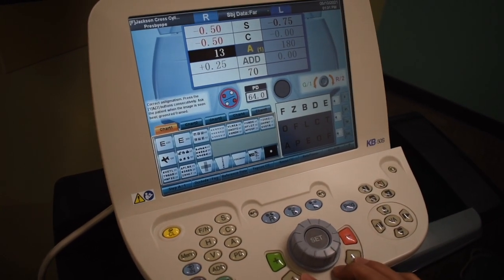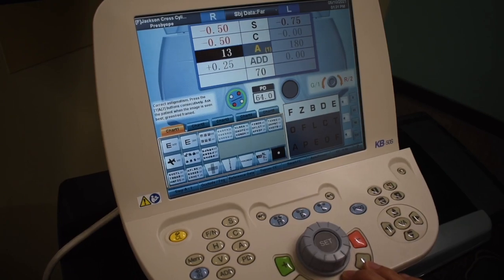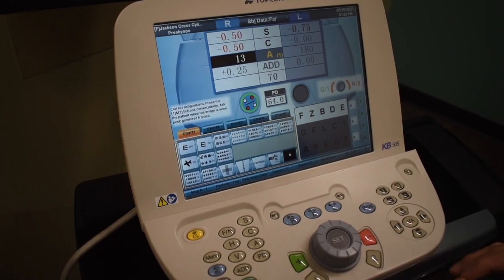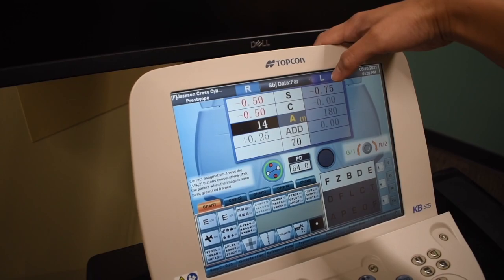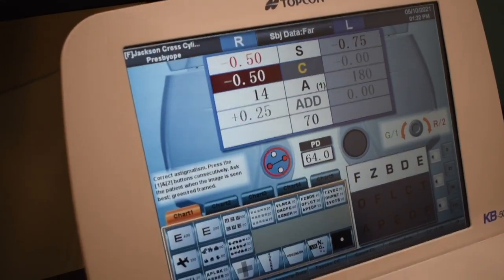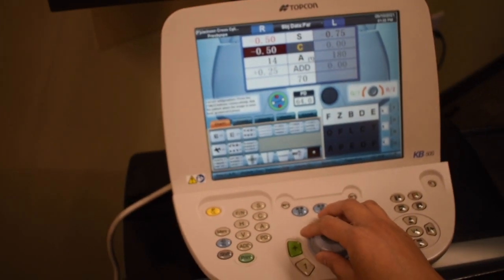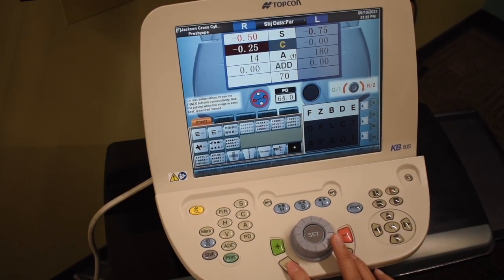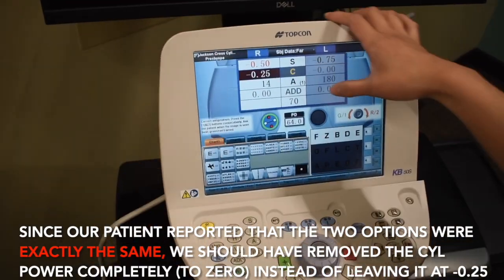Final one or two check — patient said two. Now we're going to go back to the power of his right eye. Is one or two better? Patient said two. How about one or two? Exactly the same. So we're done with the right eye power recheck.